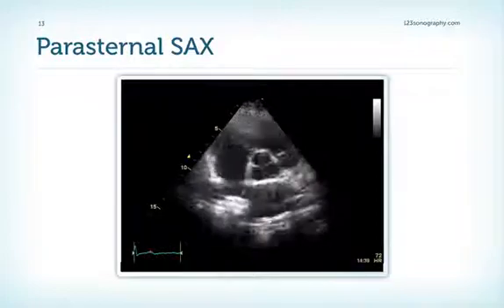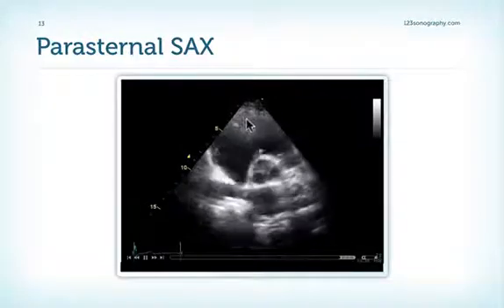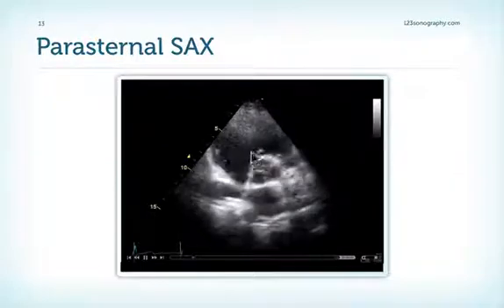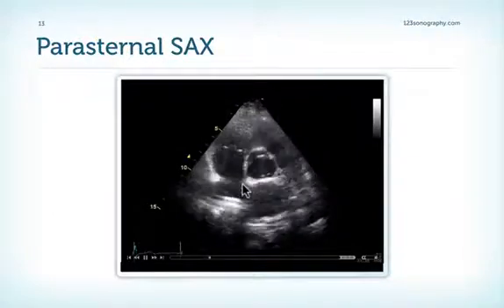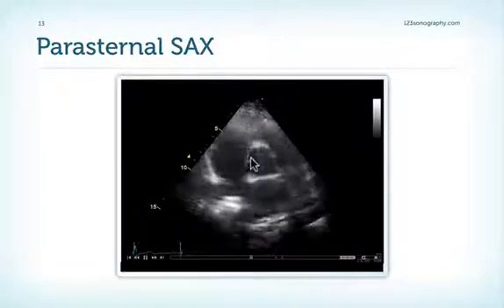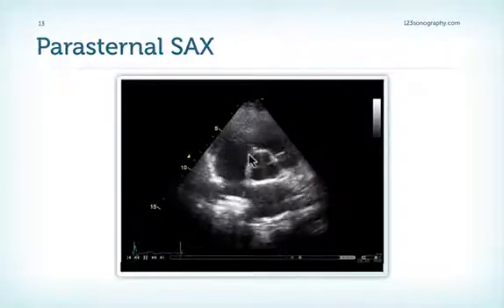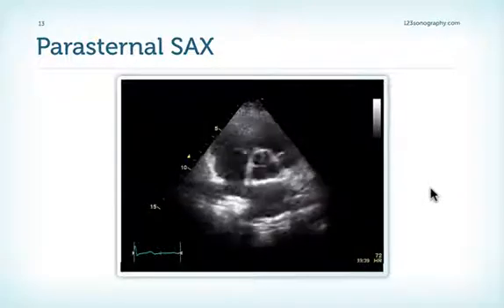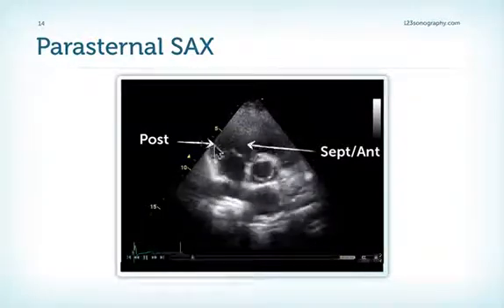Next view: the parasternal short-axis view. We have the tricuspid valve here. Which leaflet is this, and which leaflet is this? This is close to the interventricular septum extending down to the left ventricle from the aortic root, so this could be the septal leaflet. But since we are tilted fairly far anterior, it could also be the anterior leaflet. The other leaflet here is most likely the posterior leaflet.